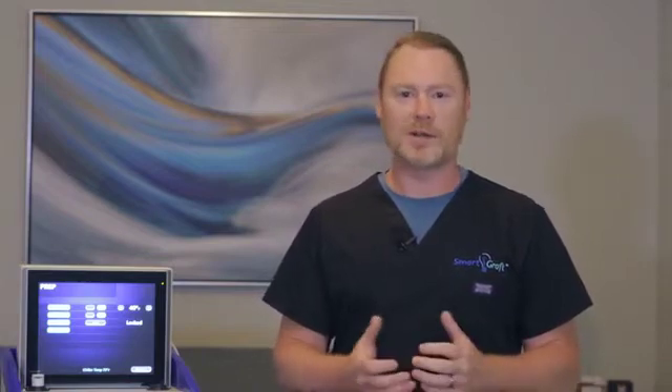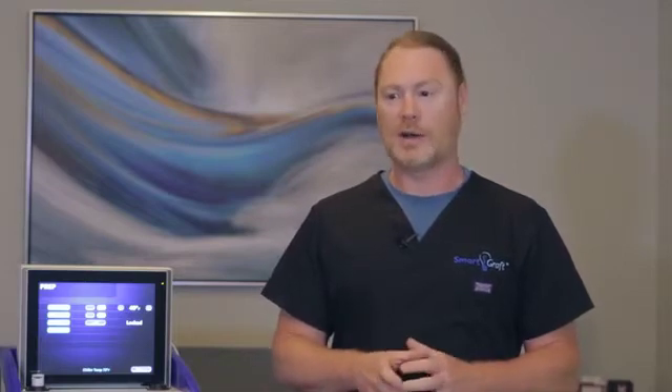My name is Michael Barge. I am with SmartGraft and I am one of their technicians. Today I'm just going to go over the setup of the SmartGraft device itself and all the functionality that it includes.